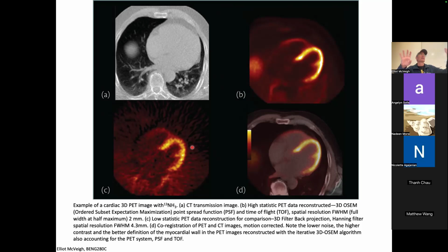And it's caused this mottled appearance of the image because of our filter, which, recall, started at the origin at 0 and went up like a ramp. It's called the ramp filter, used in order to do this reconstruction. So we got all this noise.